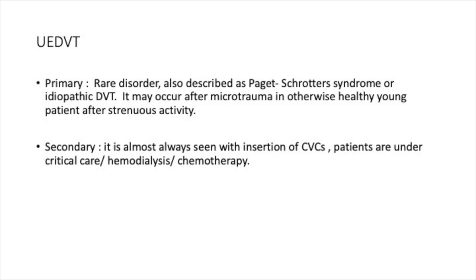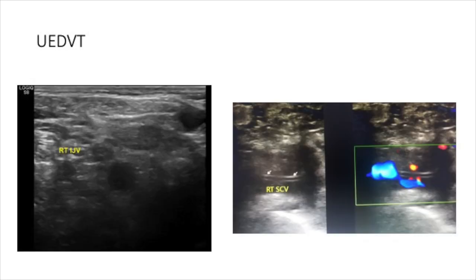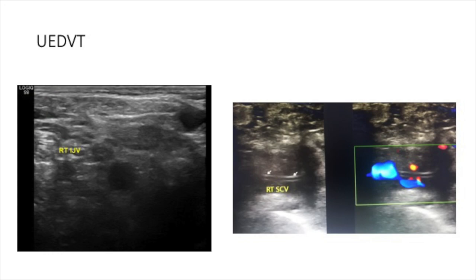Primary upper extremity DVT is a rare disorder, also described as Paget-Schroetter syndrome or idiopathic DVT. It may occur after microtrauma in otherwise healthy individuals after strenuous activity. Secondary DVT is almost seen after insertion of central venous catheters in patients under critical care, hemodialysis, and chemotherapy. This is an example where you are lucky enough to directly visualize the thrombus — the vein is almost obliterated in the internal jugular — and here you can see a partial thrombus occluding the right subclavian vein.